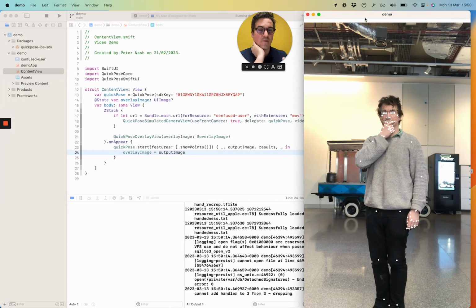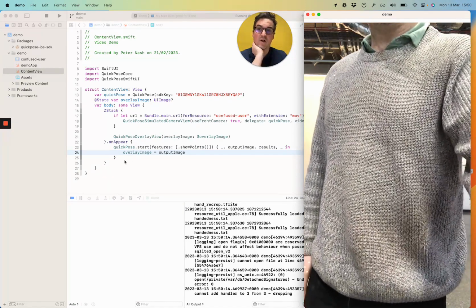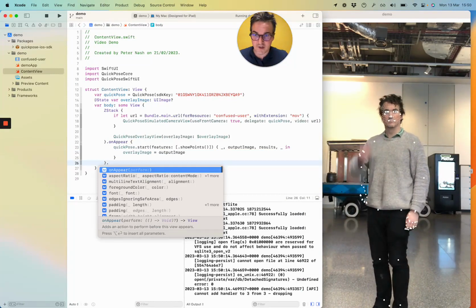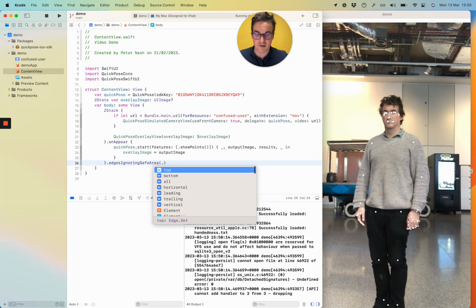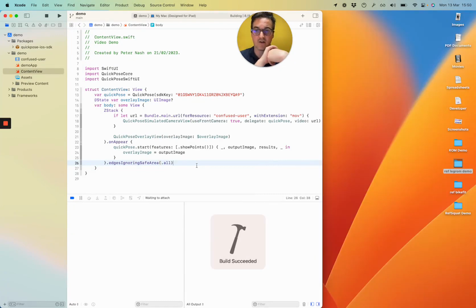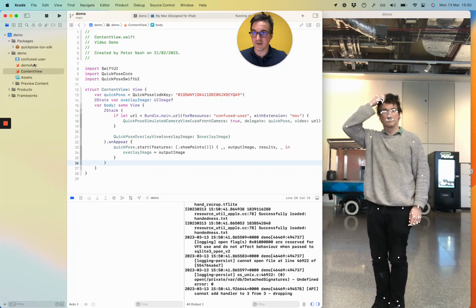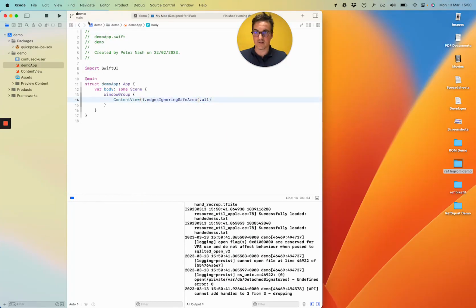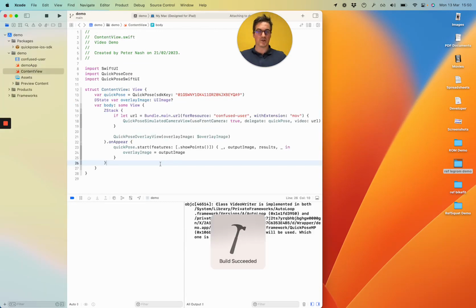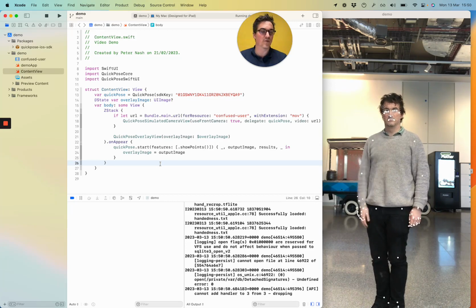Okay, the focus of this is actually to make it like a production-ready application. So details like this white gap here, I will be addressing. This is because the safe area is being respected. So I'm just going to choose it to ignore all edges. And what I'd actually suggest is don't even have this in this view. Call it up here, just so all your views have it by default and you don't even need to think about it. There we go. This is particularly important for full screen applications like a camera.